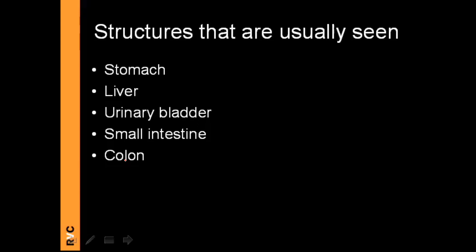Most people haven't realized that we don't always see all the organs and structures in the abdomen. Structures we commonly see include the stomach, liver, urinary bladder, small intestine and colon, especially the descending colon.